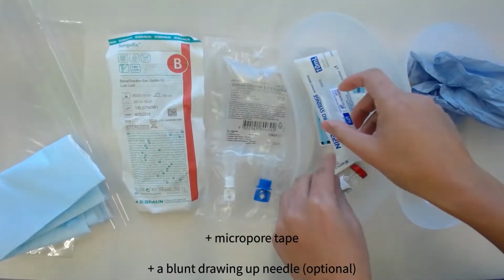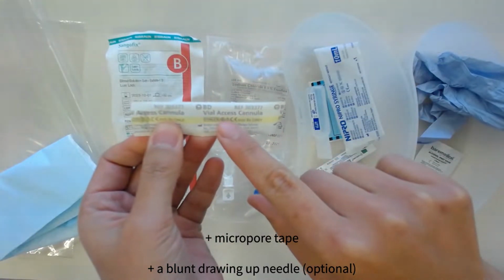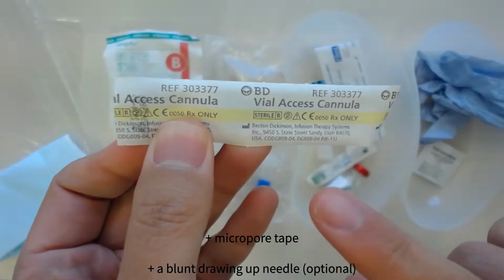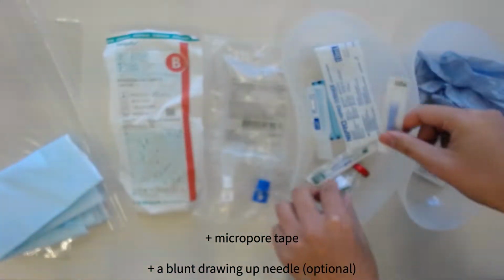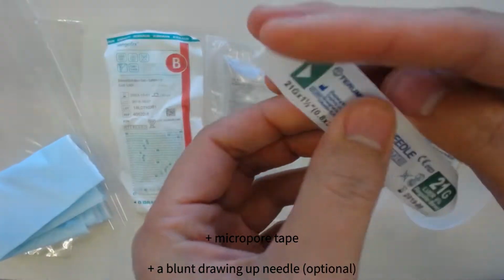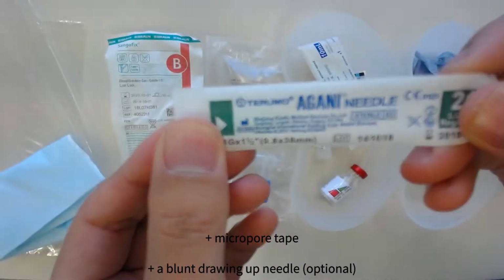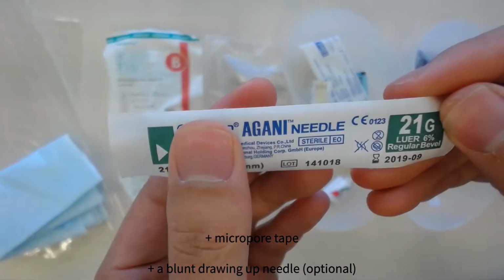Here is my vial access cannula. I'm also going to need a 21 gauge needle. This is a sharp. It's also optional to get a drawing up needle, which I'll show you how to use momentarily.